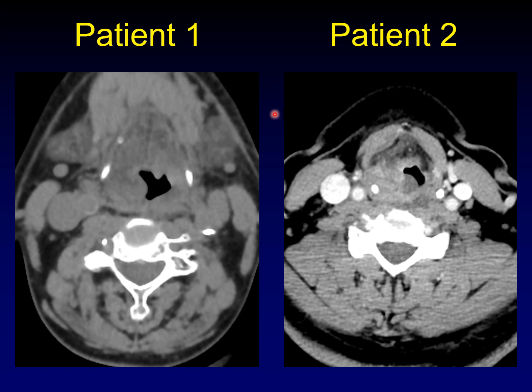What do they have in common? The most striking thing is the thickening of the soft tissues in the right supraglottis in both of these cases. Unfortunately, this one is non-contrast, but I think you'd find it looked a lot like this one overall.